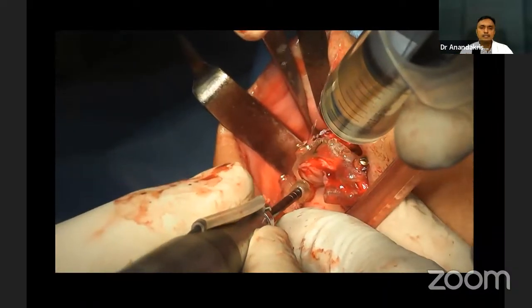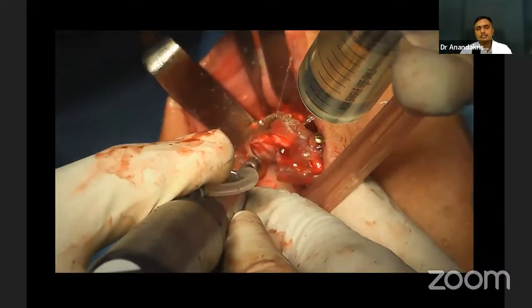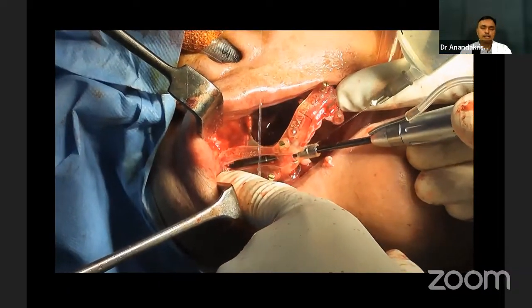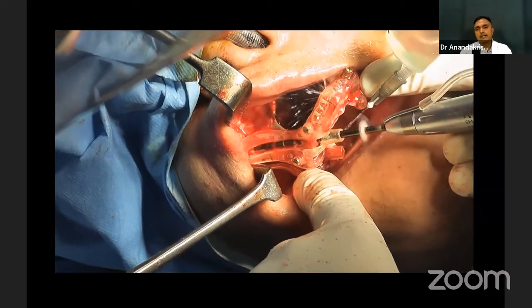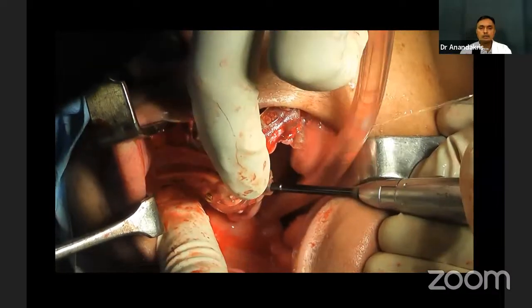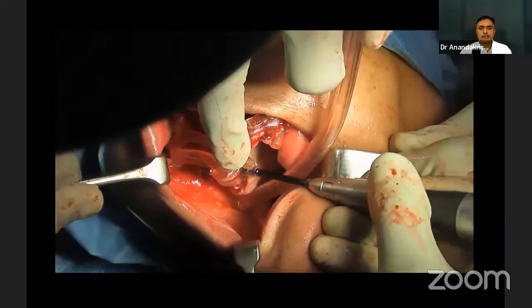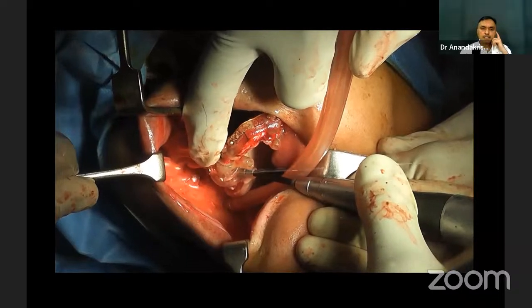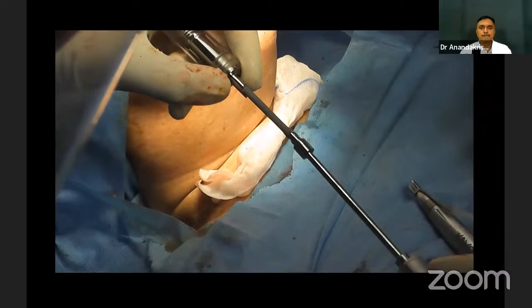The idea is you don't want to change the angulation of the zygomatic implant. If there is about a 5 or 10 degree change in angulation, it means that the implant will be entering either the orbital area, or it will go into the temporal fossa. You don't want these things to happen. You want to be exactly in the position where you come out of the lateral aspect of the zygomatic bone. That's the implant.